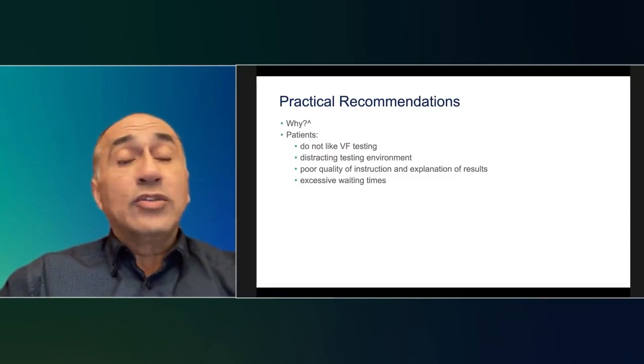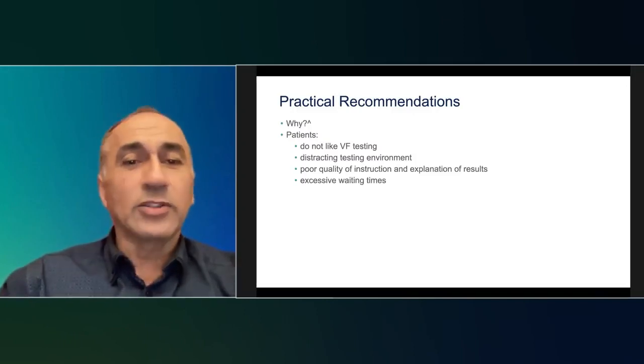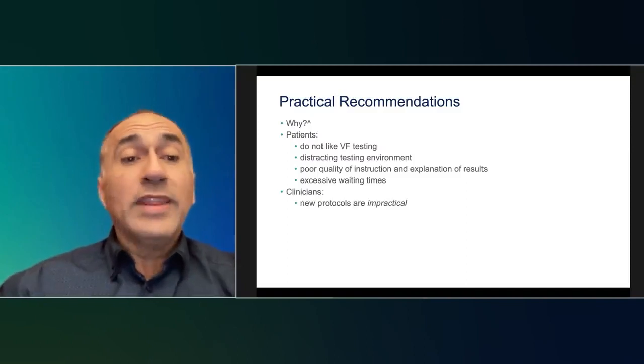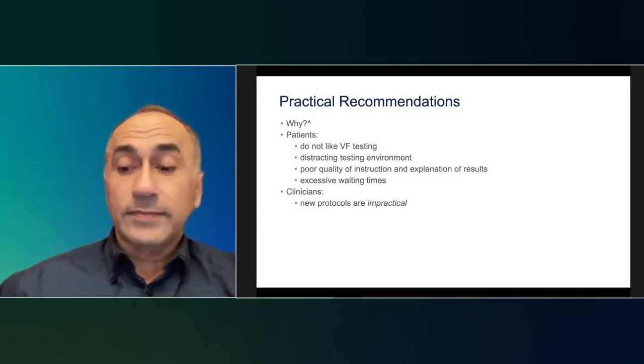And when they had to do visual field tests, there was excessive wait time. So they'd see the orthoptist, for example, then had to wait for an hour for the visual field test machine to be clear and then wait another hour to see the ophthalmologist for their new prescription drug. So they hated doing it for all those reasons. When they asked the doctors, the clinicians said in one sentence, the new protocols are impractical. That was their reason.